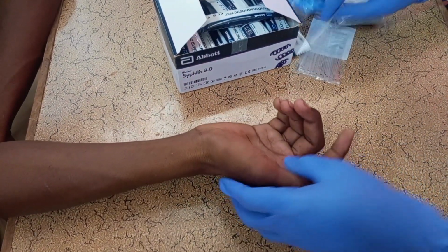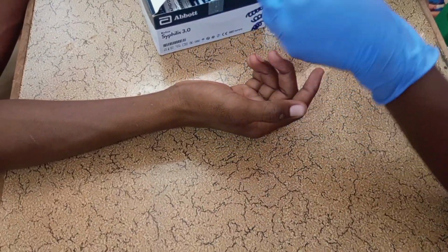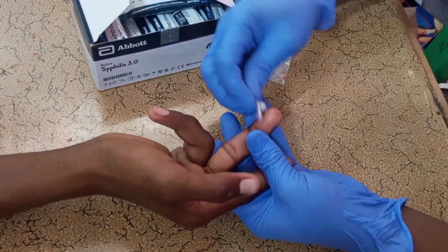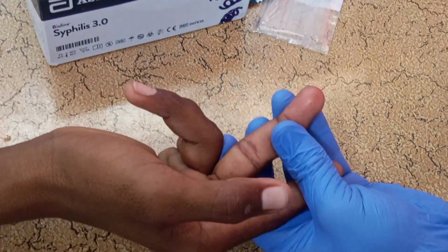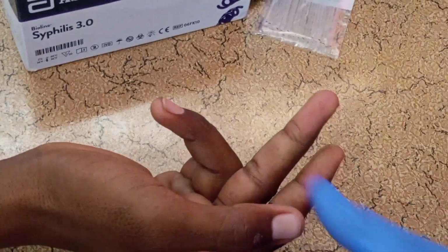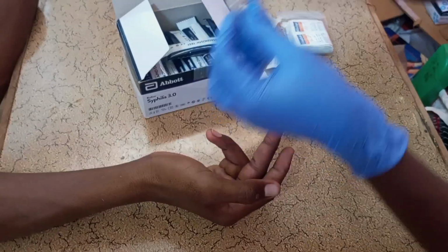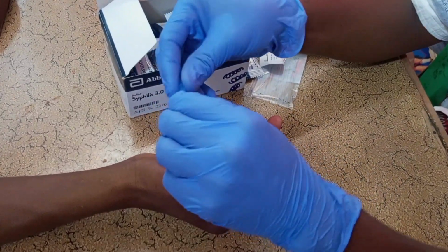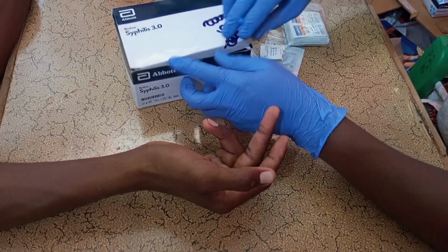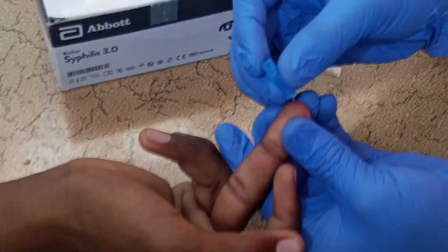First, you clean the finger with an alcohol swab. Then you dry it gently. Then you get your lancet and you do the finger prick.